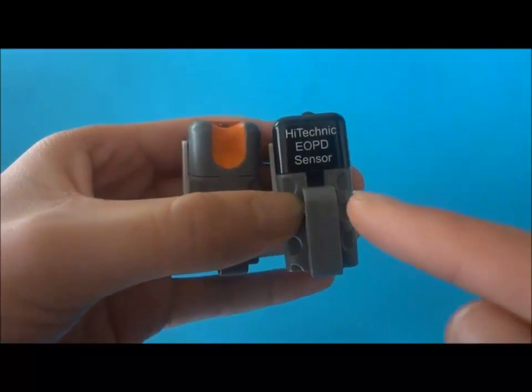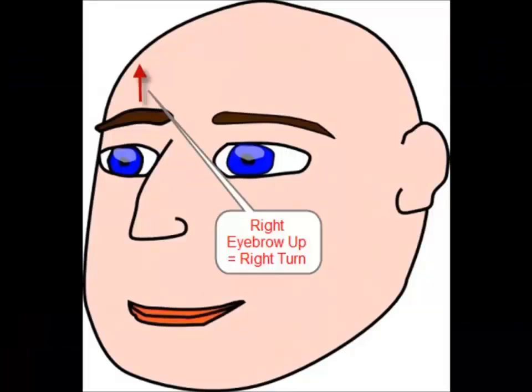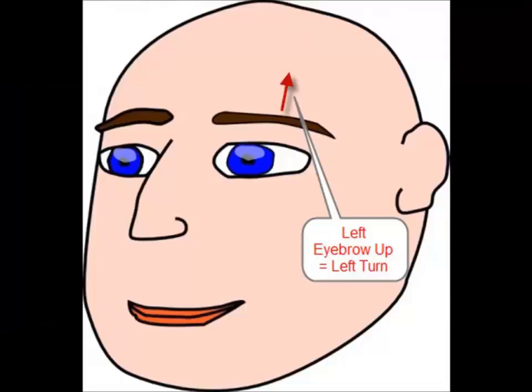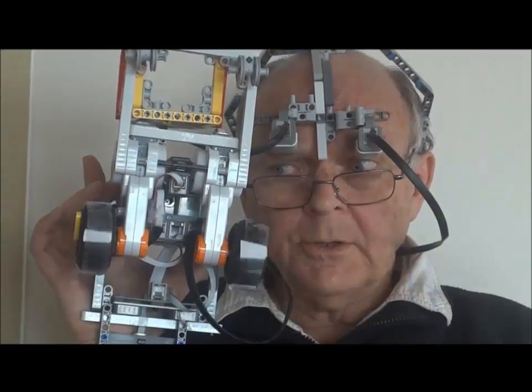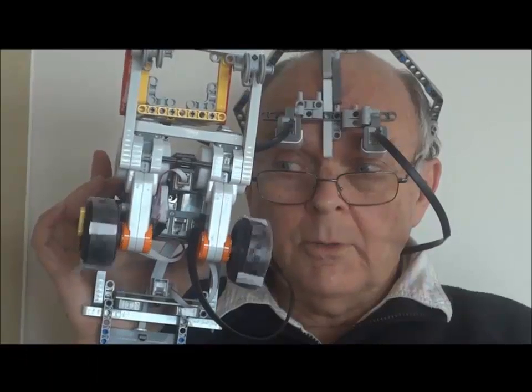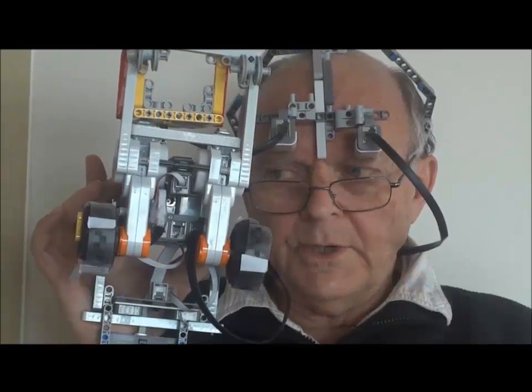I can use the eyebrow to control the wheelchair. Right eyebrow up, we do a right turn. Left eyebrow up, we do a left turn. With both eyebrows up, we can go straight ahead. And with both eyebrows in their normal positions, we stop.